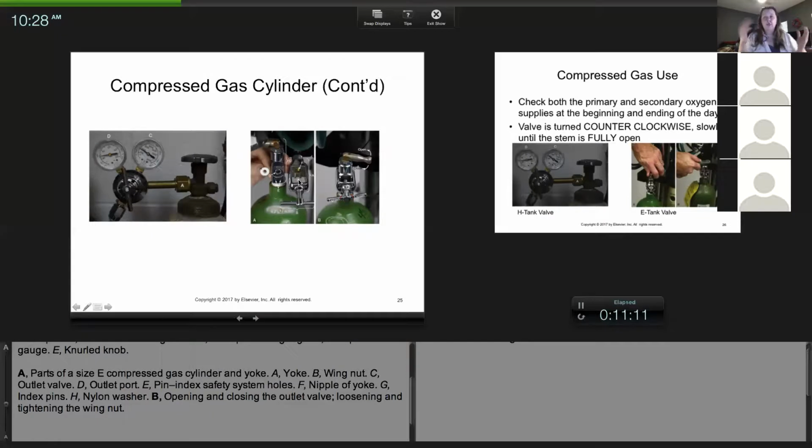So if I asked you, how do we maintain safety with tanks? There is a pin coding system and there is a color coding system. So first match the color, but the other thing is the pins only fit, think of it like receptors and neurotransmitters. They only go to their receptor. Okay, it's specific. Does anybody not understand what I'm talking about?